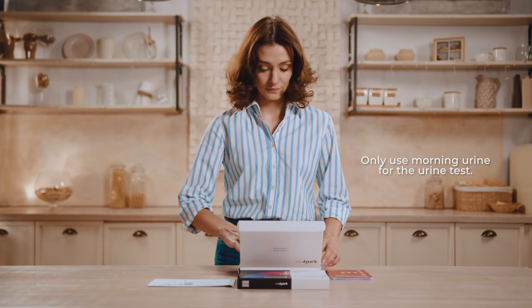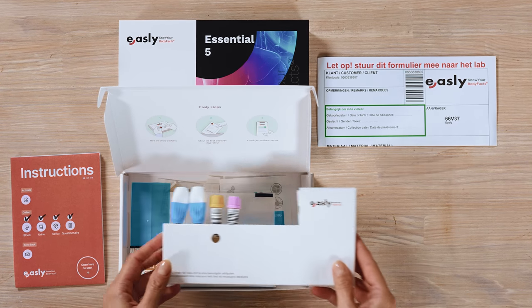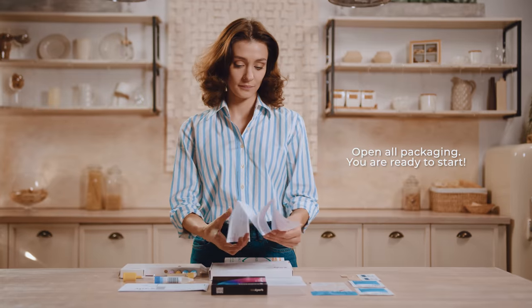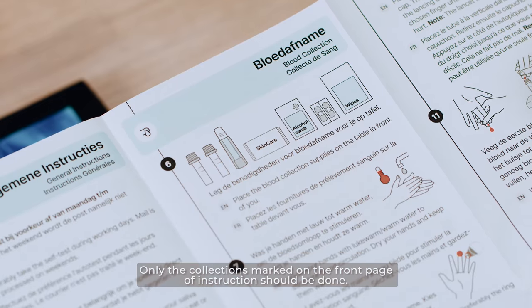Only use morning urine for the urine test. Do not eat or drink before the test. Open all packaging — you are ready to start. Only the collections marked on the front page of the instructions should be done.